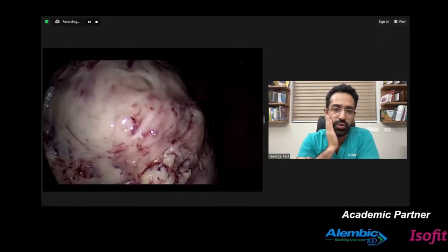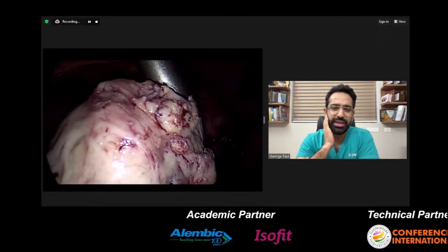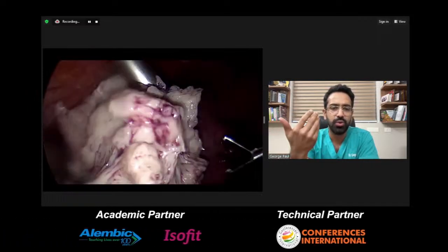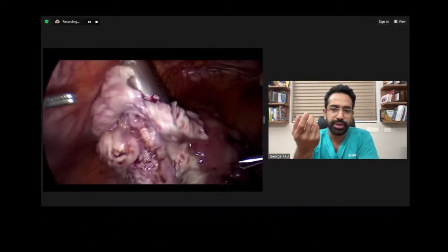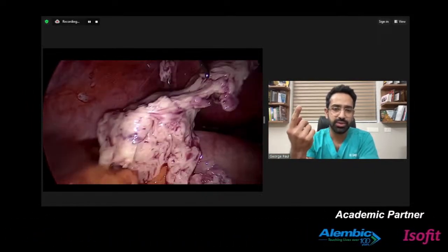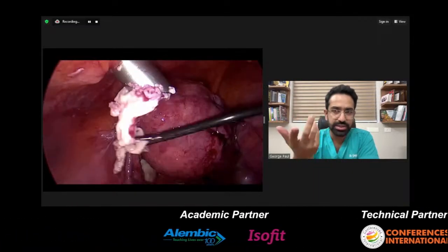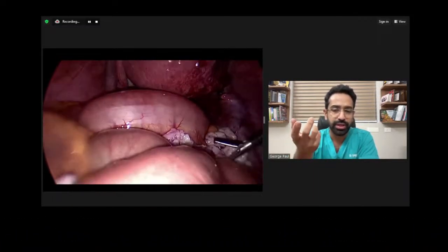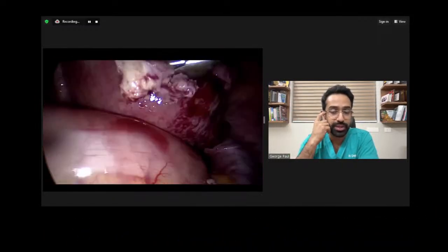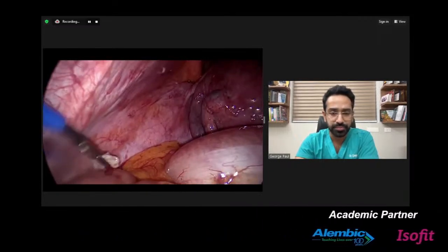And here you can see how the myoma is being morcellated. So this was sort of the beginning. The skills of morcellation are also developing. And no matter how skilled you are, inevitably pieces will get thrown away. And sometimes it just keeps spinning on the blade as well, as you can see right now. So these are all situations where, because of centripetal force, pieces get thrown away. And as much as possible, we try to pick up all the small remnants of pieces that got thrown away, and we retrieve them as much as possible.